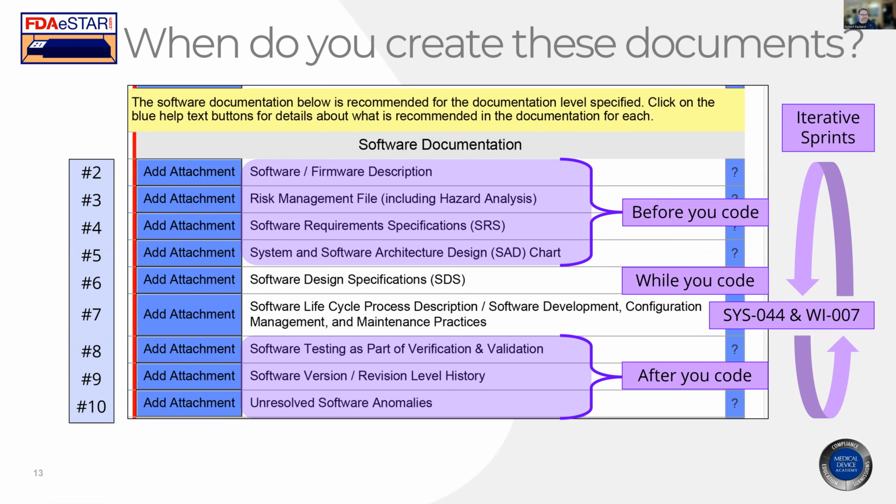And then at the very end, after you've done your coding, you're going to do your verification and validation testing. You're going to identify problems and go back to the beginning and add new requirements or revise your code. Maybe you identified a new hazard. Maybe you did cybersecurity testing and it failed and you had to go back and change it. So different types of verification validation tests. We have cybersecurity verification, vulnerability testing, pen testing. Every single vulnerability you find, go back and fix something. Oh, new bug we found, new hazard.